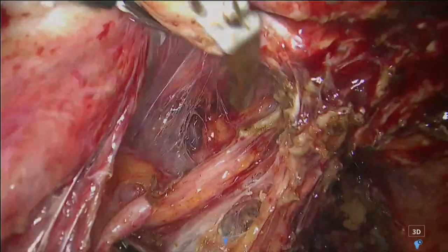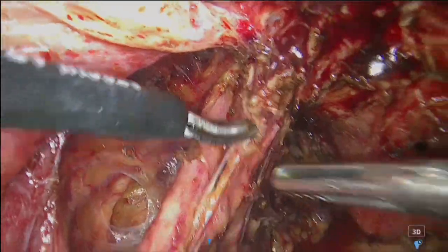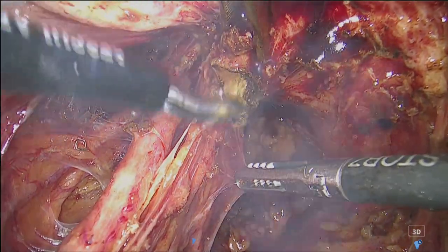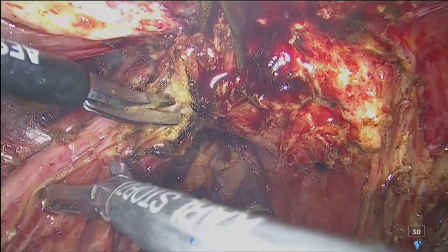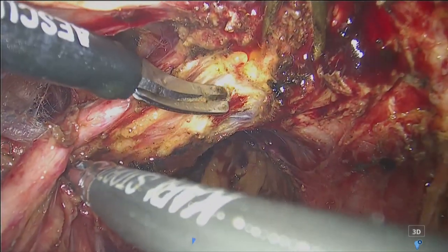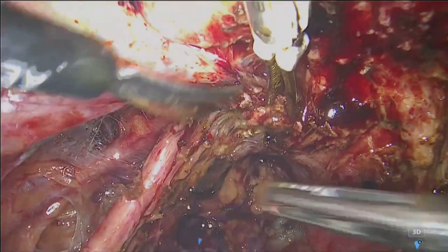I stay here under the uterine artery, and we see this is the part of the infiltration, but here is totally soft. It's here is superficial lesions. I stay very close to the uterus. It means that there is no risk of resection of the narrow part of the dorsal parametria that Mariana, she's pushing laterally. I say superficial here. Here. Okay. And then we go stay here, you see.